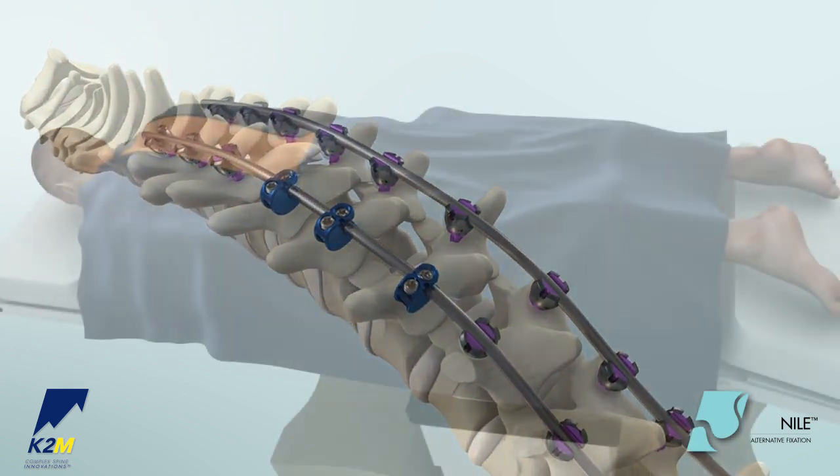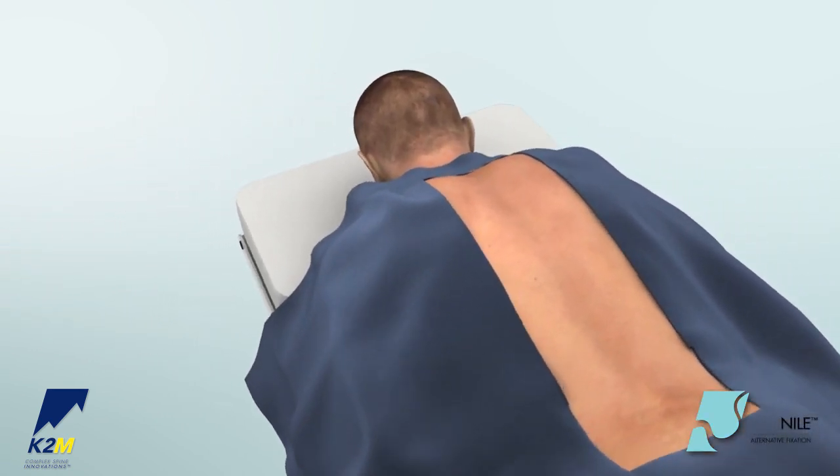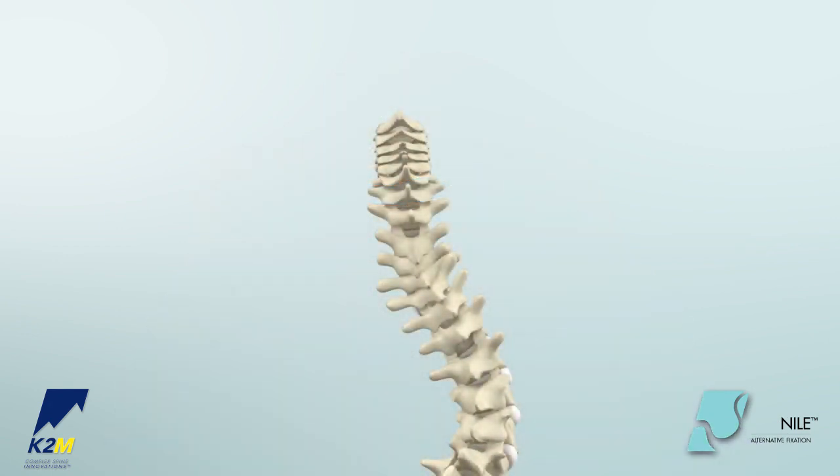Position the patient for a posterior approach. Prepare the lamina for band passage by removing at least 5 mm of the ligamentum flavum on both the cephalad and caudal ends of the lamina.